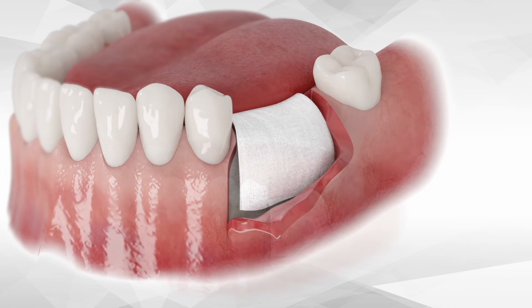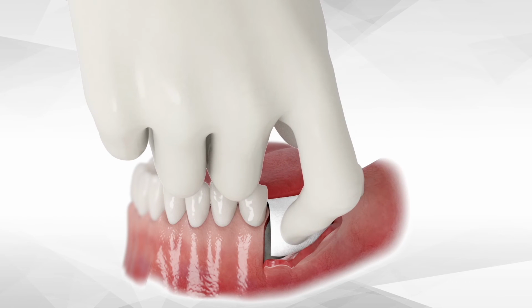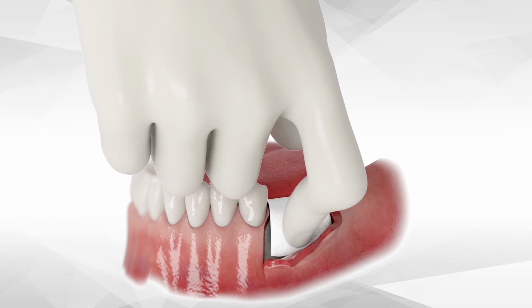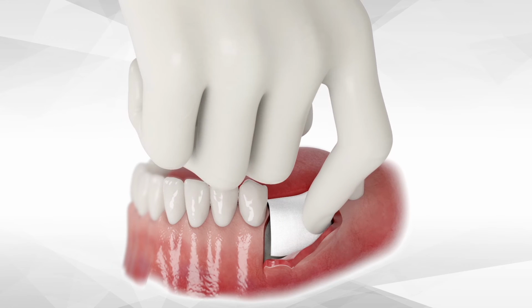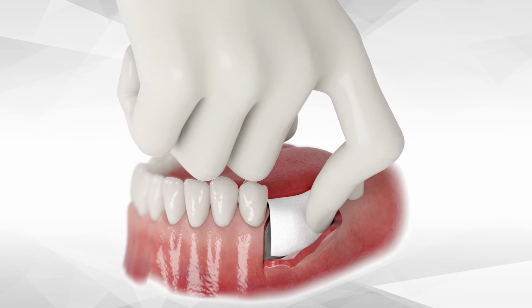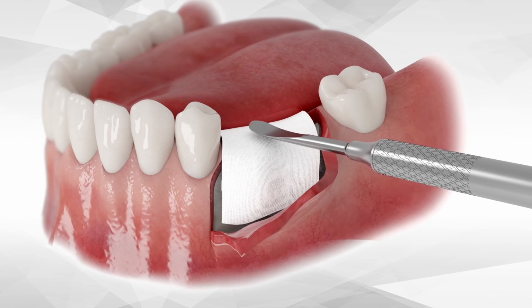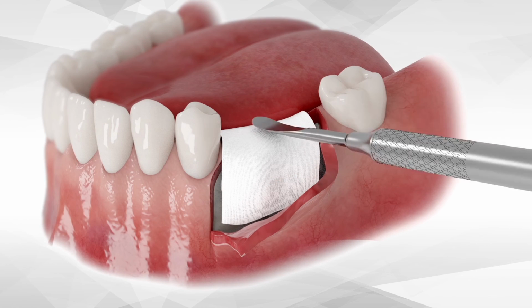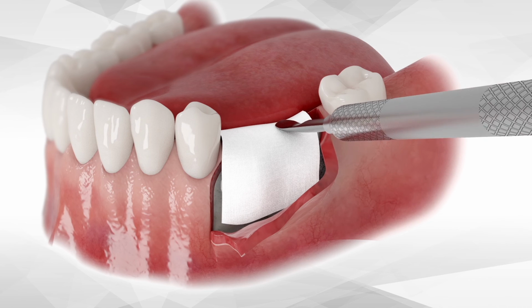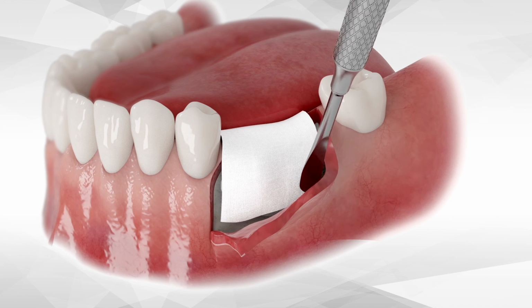Immediately, a sterile unfolded dry gauze is placed over the cement and pressed firmly with the finger from the buccal and the crestal direction for about 3 seconds. It's extremely important that the bond apatite cement will be well compacted. Thus, after pressing with the finger, use the periosteal elevator in order to continue with the compaction of the graft for an additional few seconds, again from the buccal and crestal direction.